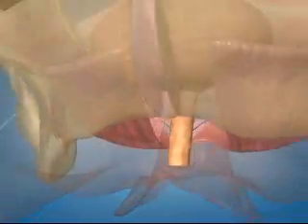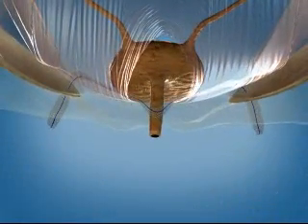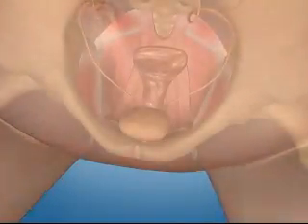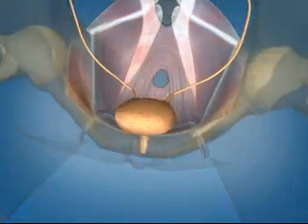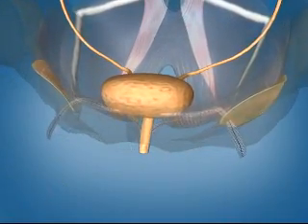Monarch's outside-to-in transobturator approach avoids the retropubic space and may reduce the risk of injury to the bladder, bowel, and other major vessels. Monarch's proven mesh creates a hammock that mimics the patient's anatomy and restores normal pubourethral support.